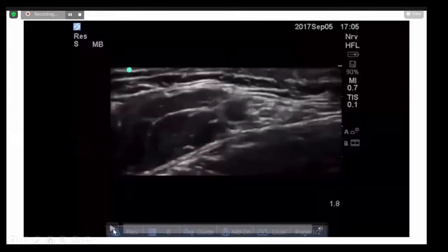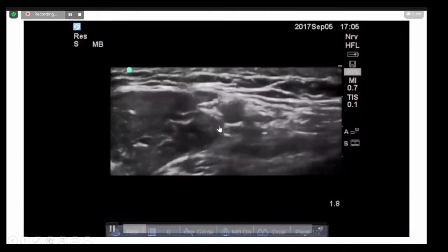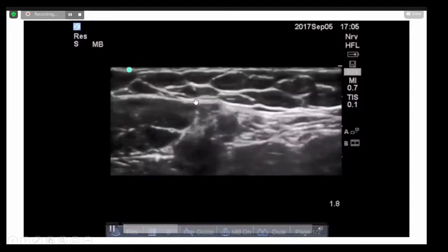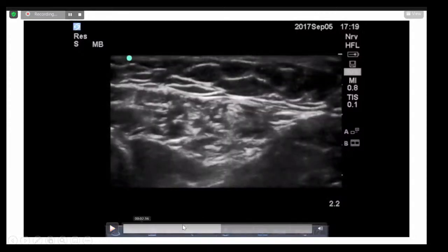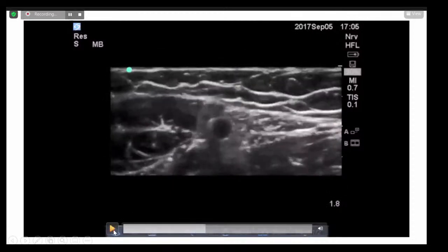This is something we did in the supra-axillary, which we have been doing for a long time now, axillary fossa block. We don't do it nowadays much, because we practice mostly costoclavicular blocks, because most of us in Sanchiti are now giving costoclavicular. So this is exactly what we see at the level of the supra-axillary. You can see these nerves which are coming, and they are forming a plexus here. Isn't it, Surjit? This is exactly where you're giving the axillary fossa block.